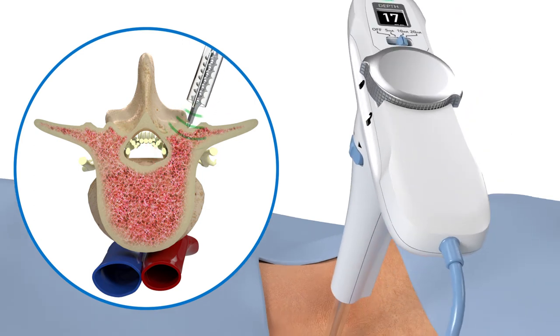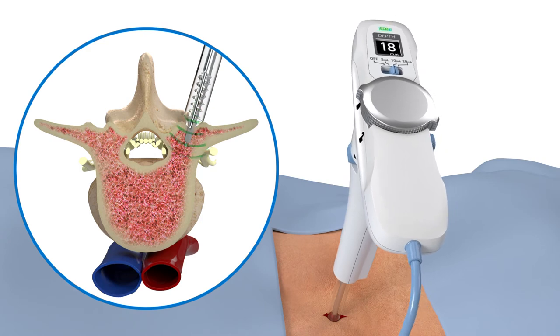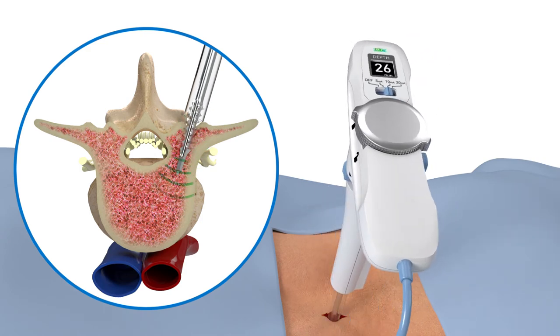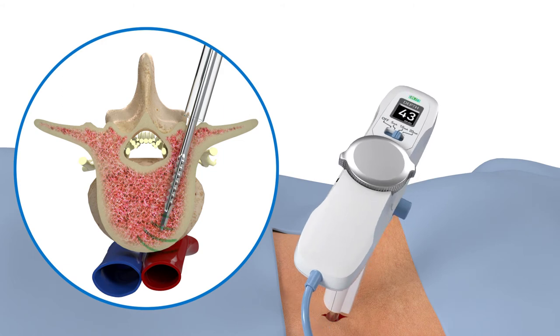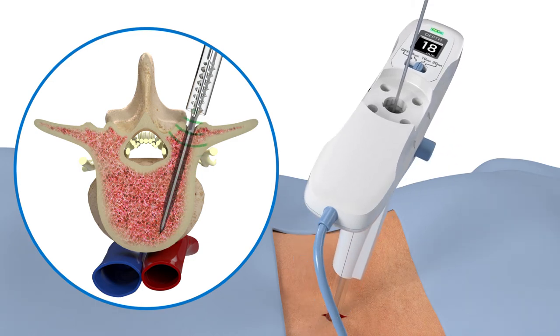Once the surgeon has configured their desired screw pathway via the digital depth measurement and triggered EMG, the surgeon can remove the inner stylet and replace it with a guide wire. Then, the ratcheting handle can be switched to reverse and the all-in-one tap can be removed.